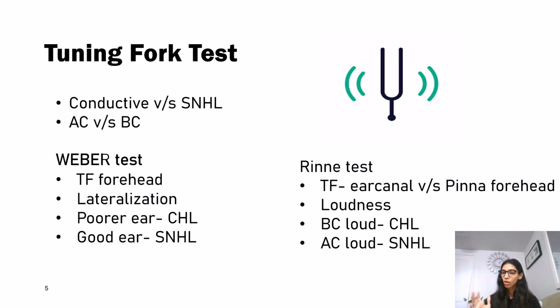The bone conduction sound is better than the air conduction sound. Air conduction is getting lost somewhere because of the conductive component. And if they say AC is louder, then they might be having SNHL, because when you're presenting AC versus BC, there is not much amplification happening, right?